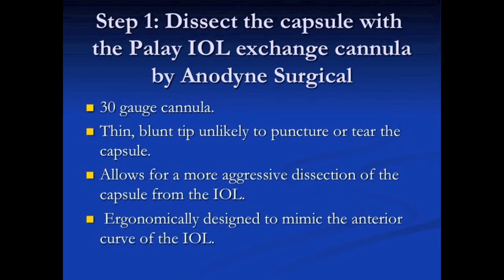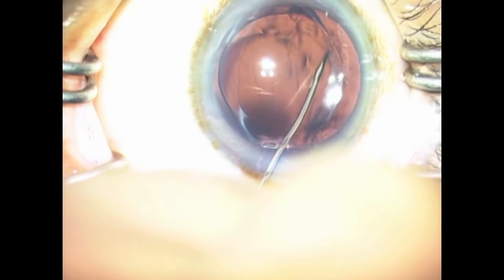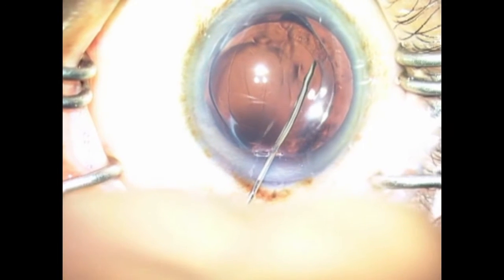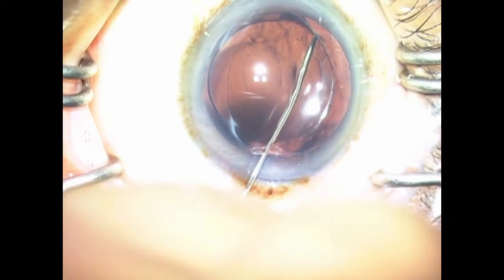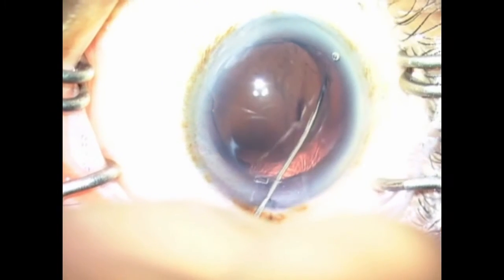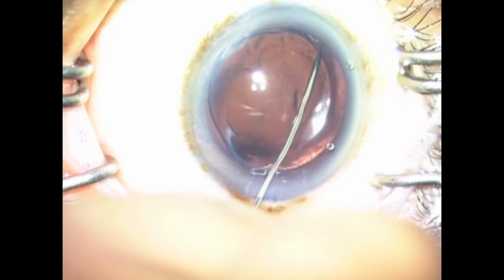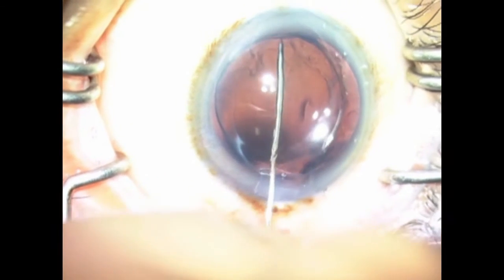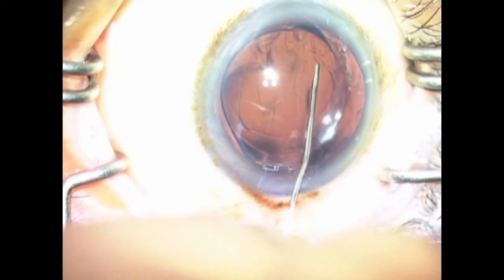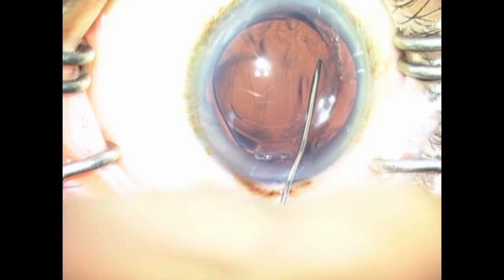Step 1. Dissect the capsule with the Palay intraocular lens exchange cannula. This specifically designed cannula is thin and blunt, which facilitates dissection of the anterior capsule from the intraocular lens. Because it is blunt, it is less likely to tear the capsule and it allows for a more aggressive dissection.